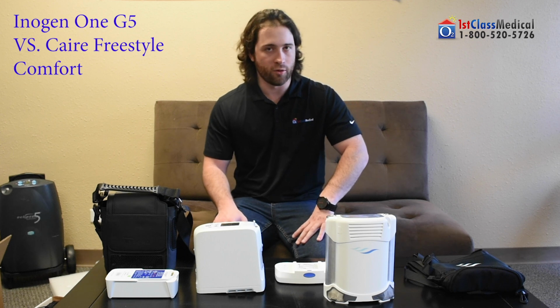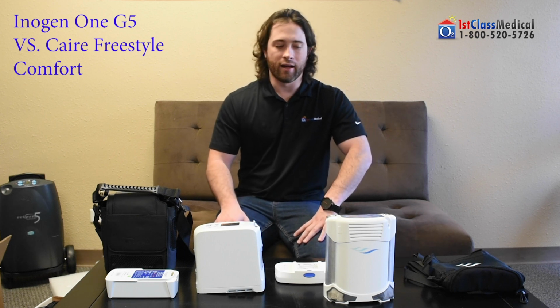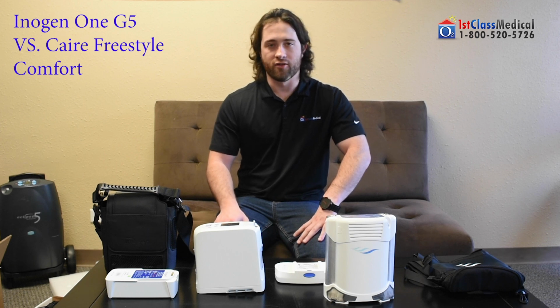They're both two amazing companies. These are both two amazing machines, and we're very, very excited to be able to offer them both to you.